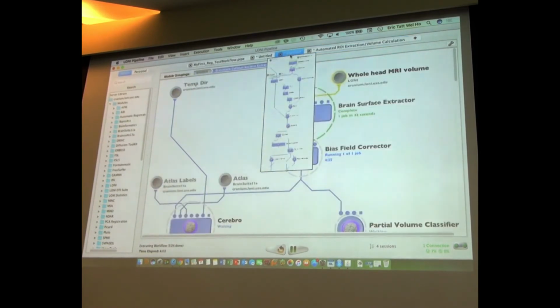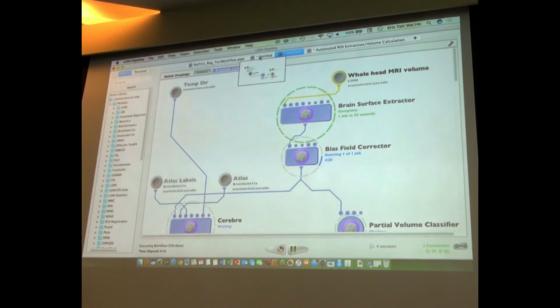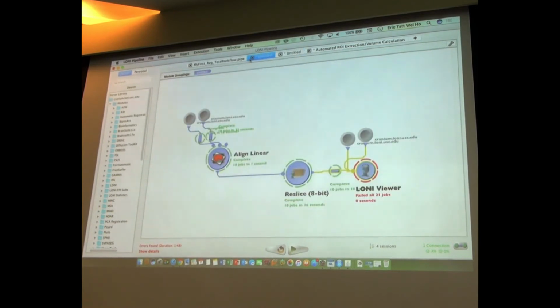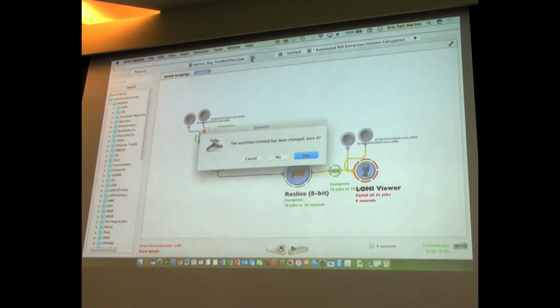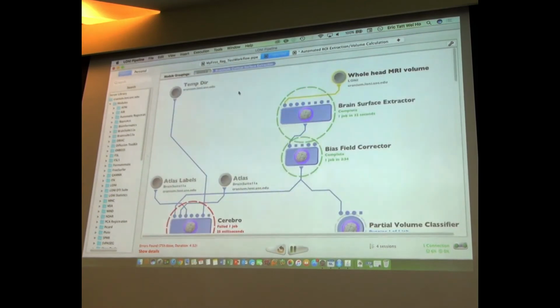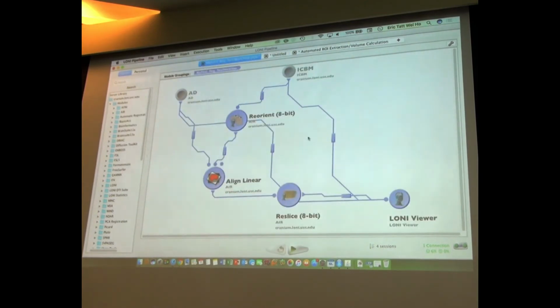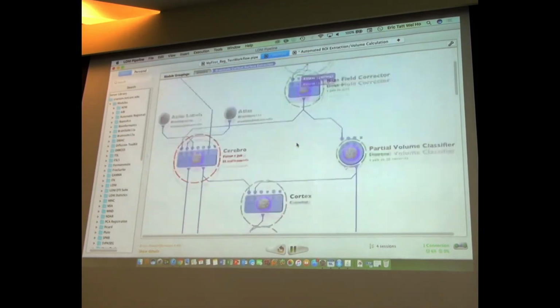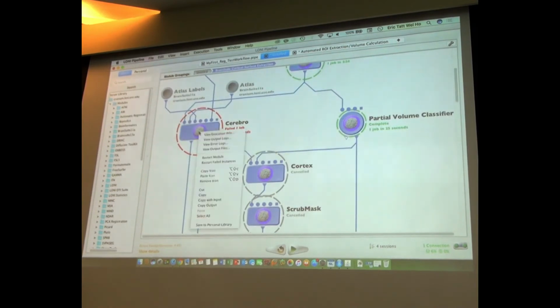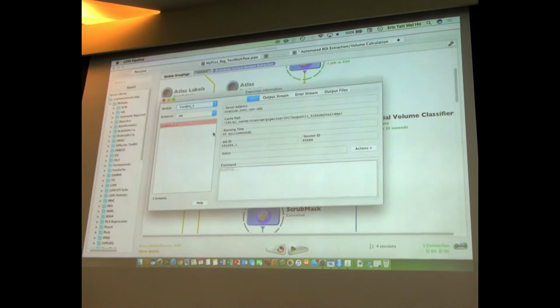So let's see. Our thing is running here. What was that? That was the thing that we just finished. So I'm going to reset that. I'm trying to clean my environment here. So this is the workflow that we finished designing, and here are a couple of workflows that are predefined. I'm just running them. Look what happened here. This workflow generated another error, so you may want to inspect this error just like we did before.